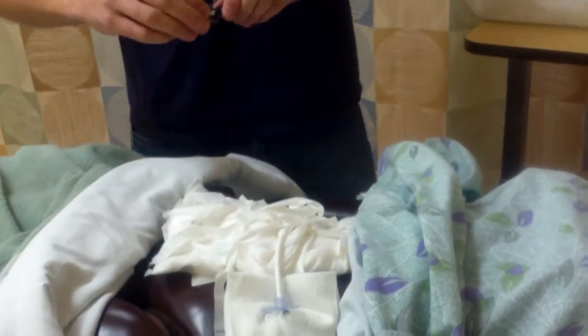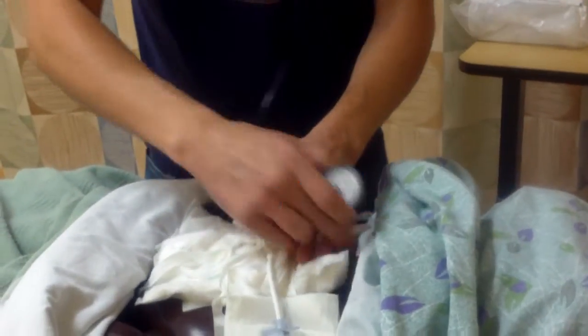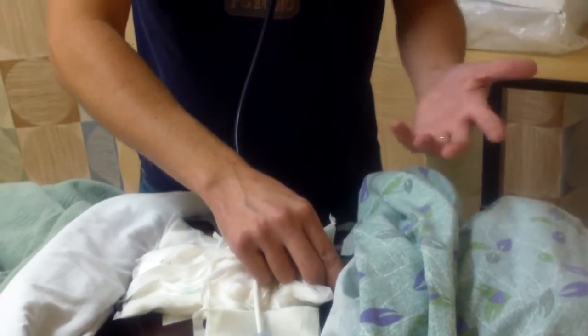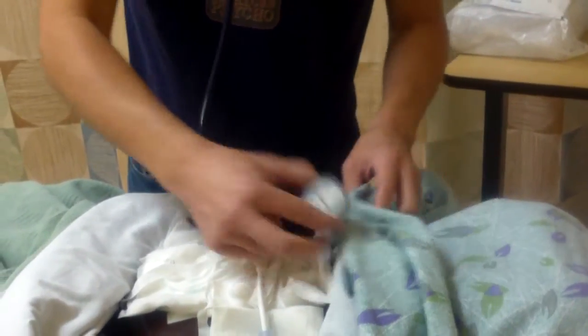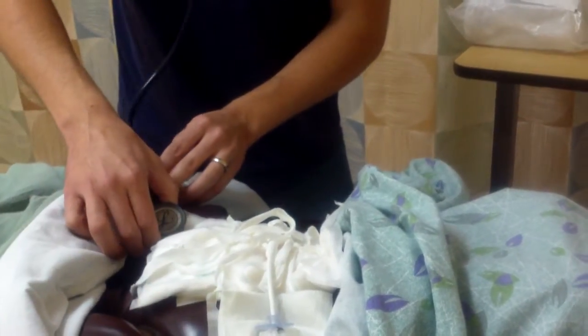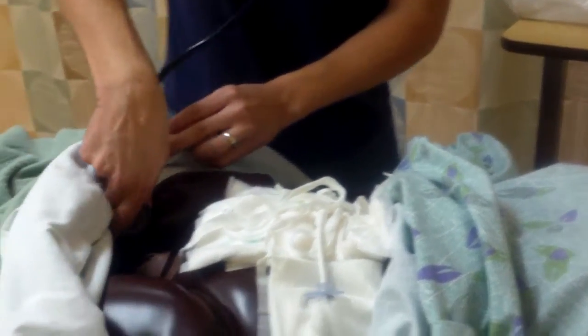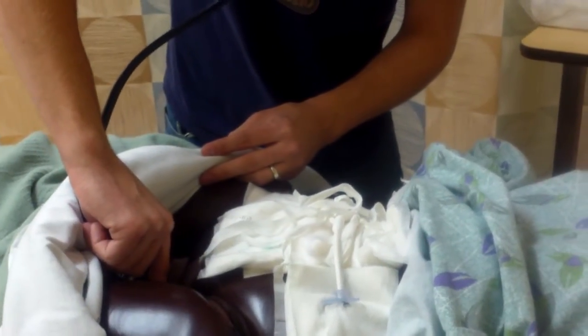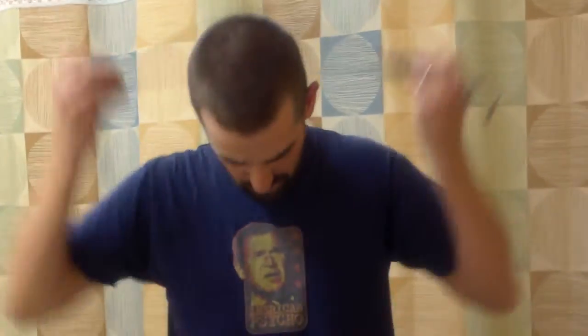All right. Then I would flip it over to the bell, and I would listen to the descending aorta. Notice for any signs of bruit, any kind of swishing sound. I'd also want to do this on the iliac and the femoral arteries. And there are no bruit sounds that I'm hearing right now. So that is auscultation.